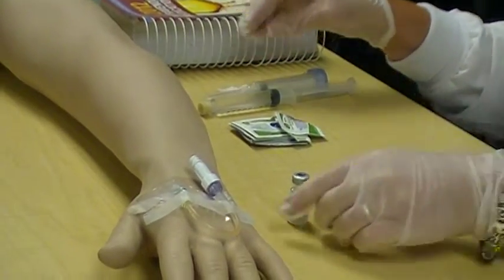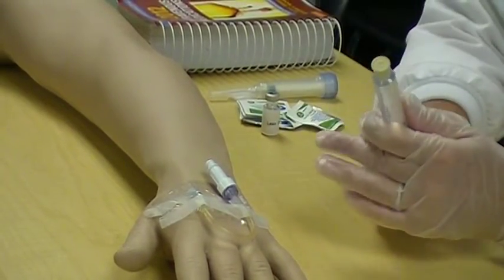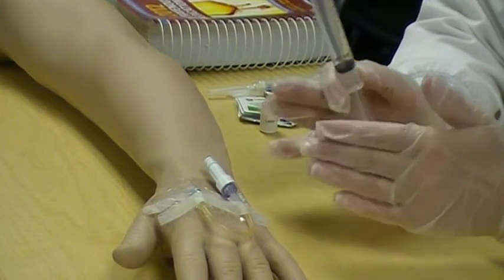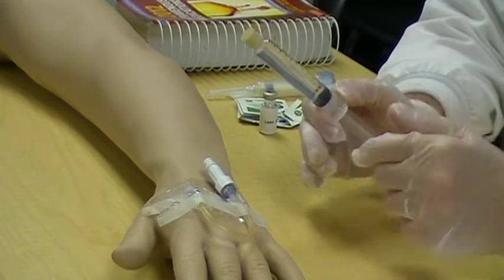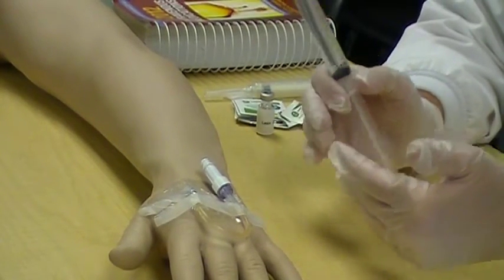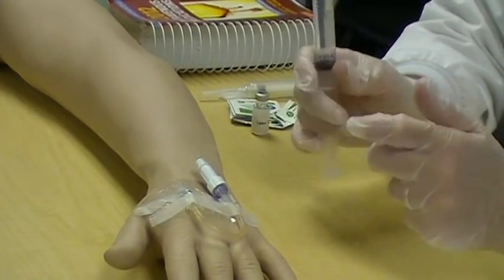Next, we are going to take our normal saline and flush this saline lock. The reason behind the first flush is to determine that our IV is patent. We don't want to be administering medications into the intravenous system if it is not a patent IV. Otherwise, that medication is just going to go into the surrounding tissues and not go into the venous system to go up through the heart and then back and through the body.